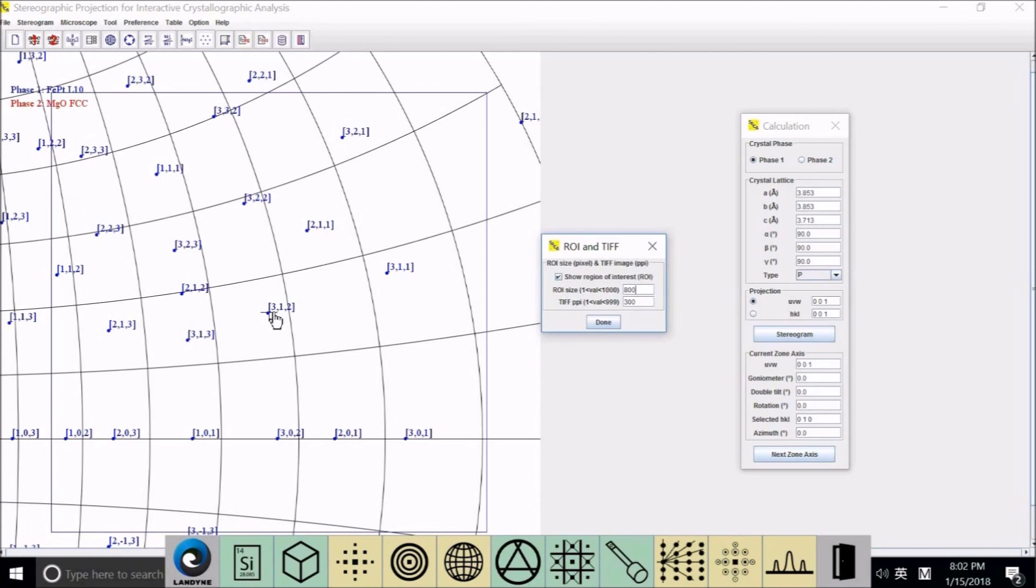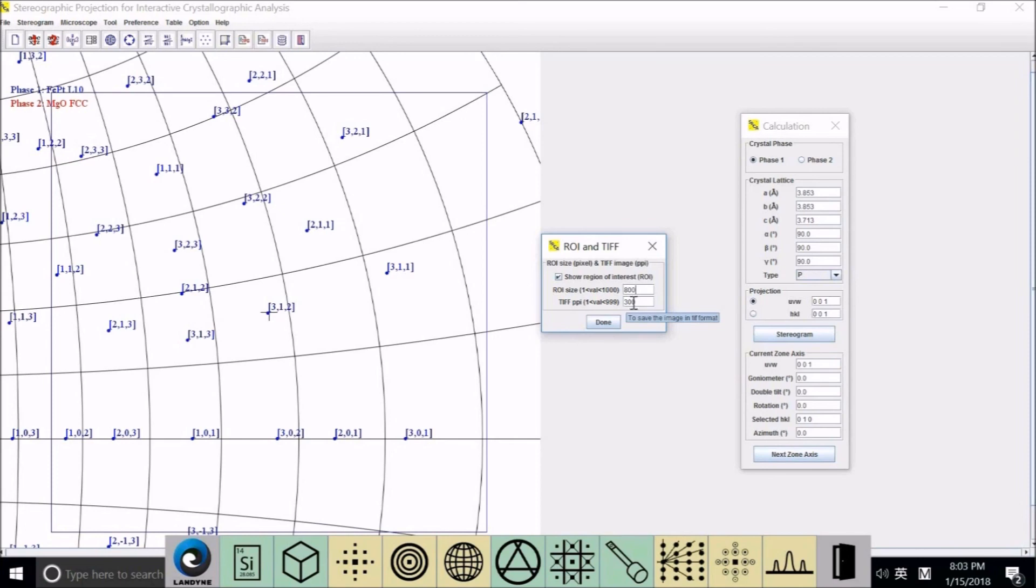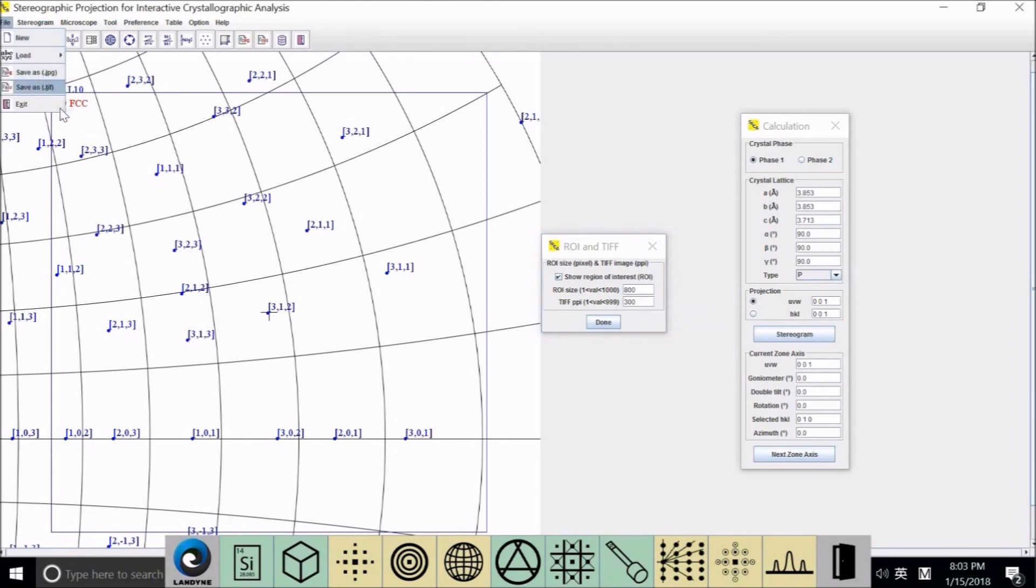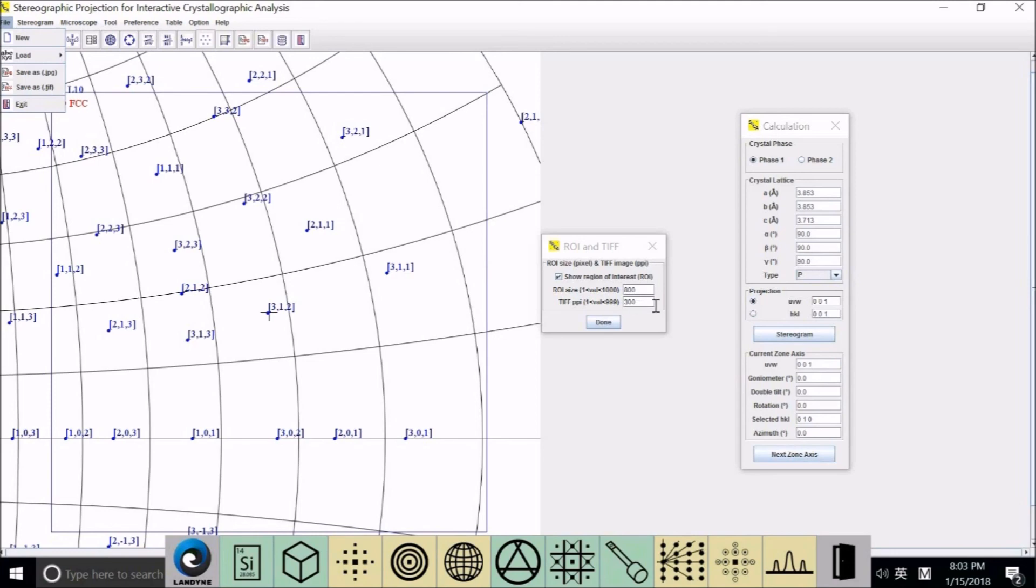This is the DPI, dots per inch. You typically put 300 or a little higher for TIFF files. Now you can go to File, save TIFF. Only inside this blue square will be saved as an image with the resolution whatever you define with DPI. For JPEG, there is no effect with the DPI. They will save the size you defined.